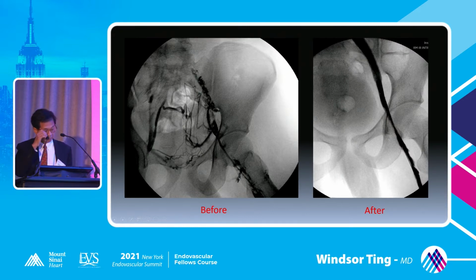You can see the venogram on the left. This was a patient presenting with acute pain and swelling in her left leg. You can see on this venogram she has acute DVT in her left common iliac vein, external iliac vein, and also in the common femoral vein. You can also see there's a fair amount of collateral, suggesting there was probably a chronic component to this acute DVT, something that we see quite often.